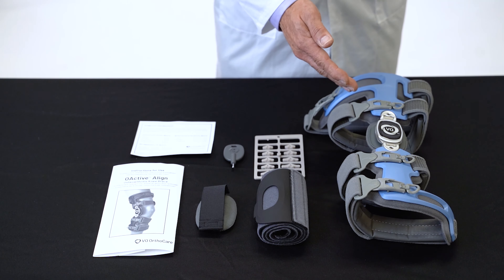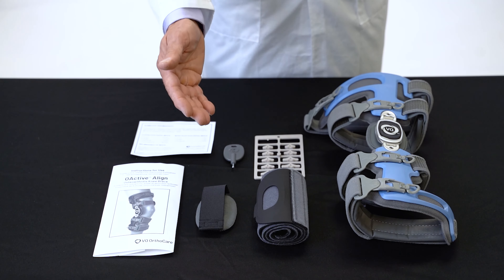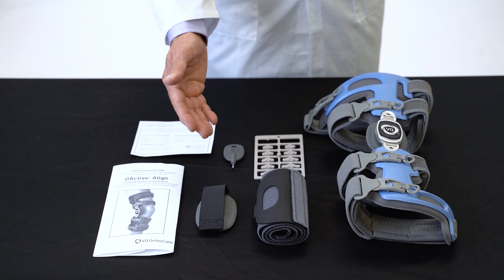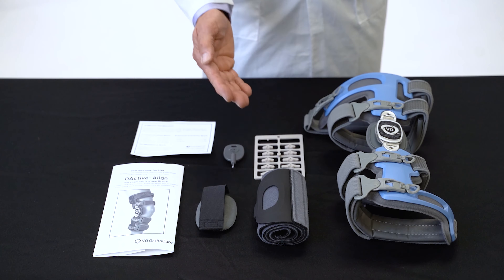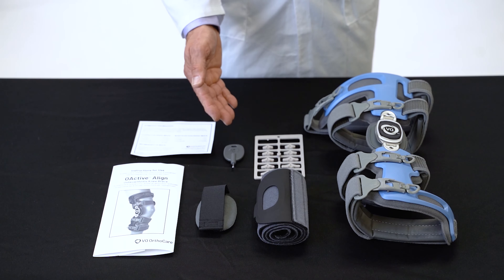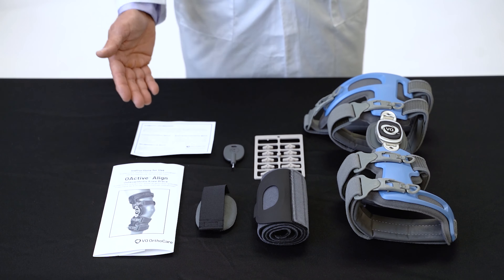The OActive Align comes with a calf suspension wrap, elastic strap extender, thin condyle pad for lateral OA, flexion and extension stops, angle adjustment key, instructions for use, and warranty card.